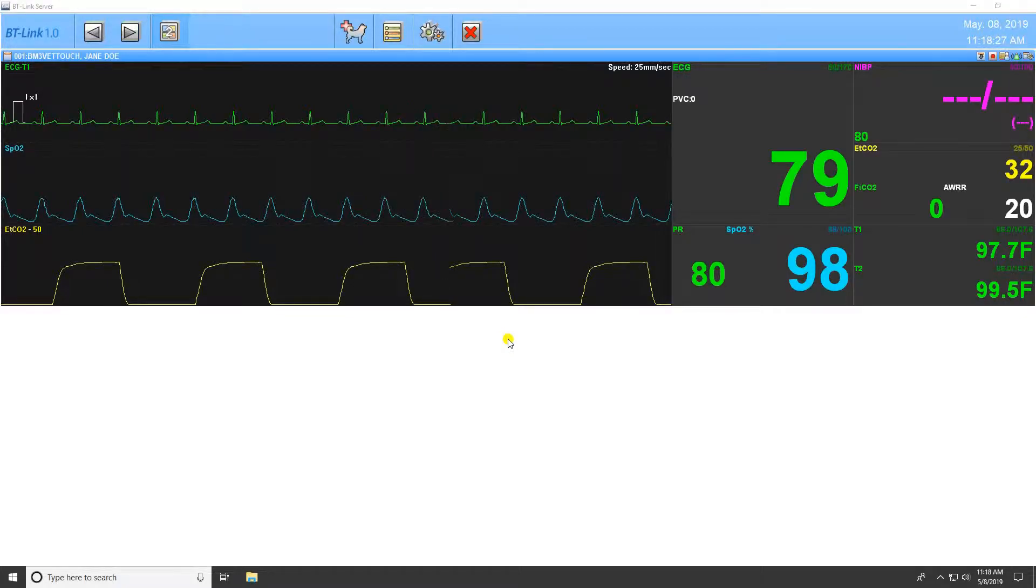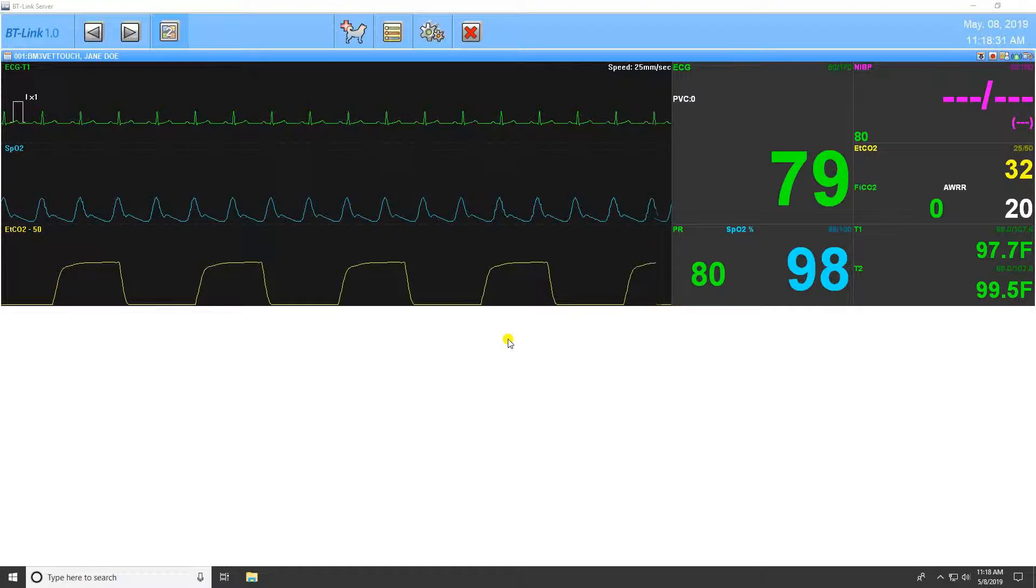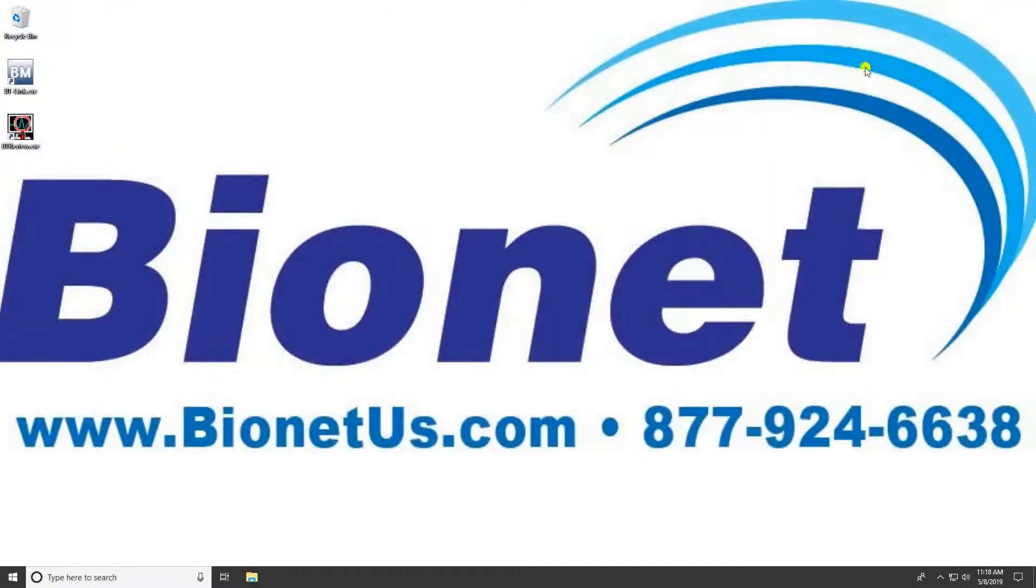BT-Link Review is a program within BT-Link to review and analyze patient data recorded by the BT-Link program. BT-Link Review can be accessed in two ways.